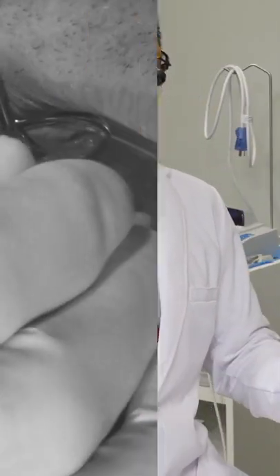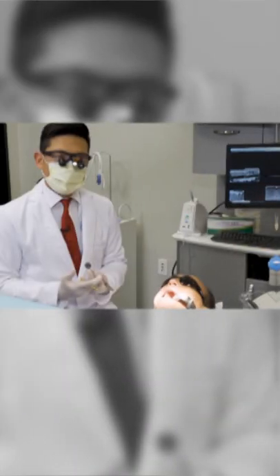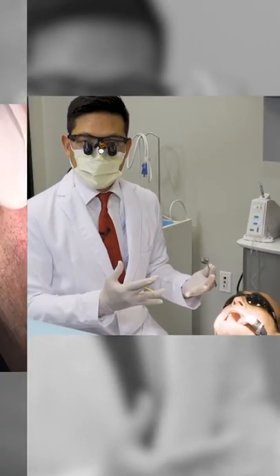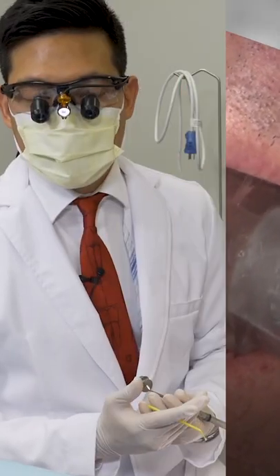This is a vital tooth. For most vital teeth, I do like to apply a desensitizer. So we're going to put a little bit of a layer of desensitizing agent. A nice way to combat that, and it has been proven to reduce the risk of postoperative sensitivity, is to apply a desensitizing agent on the preparation.